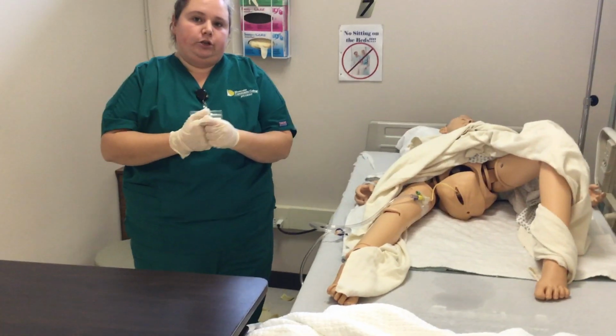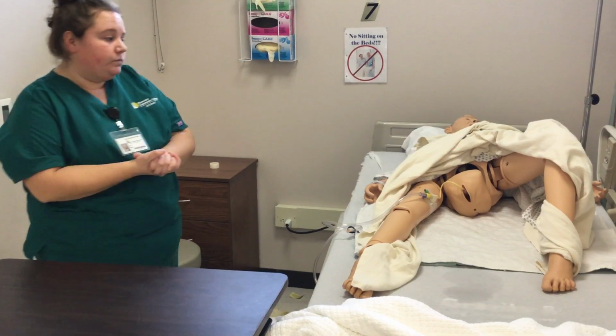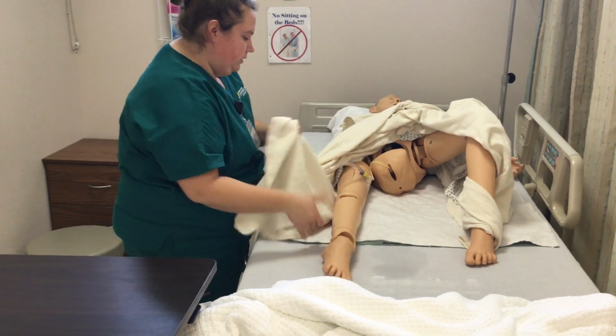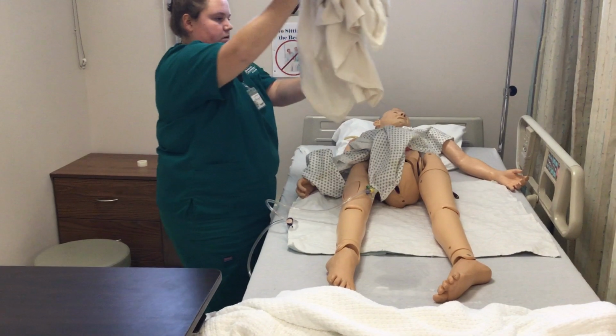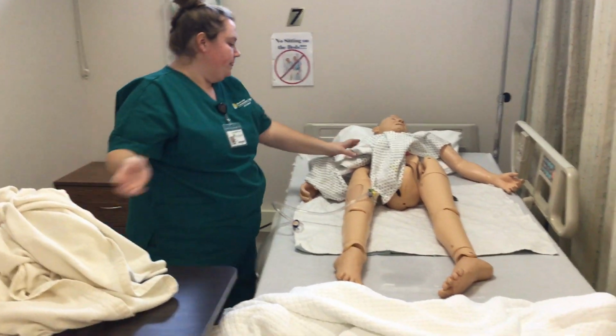This time I'm going to remove my gloves and perform hand hygiene. I'm going to get the patient in a comfortable position. I would put this in the proper receptacle and take care of it.